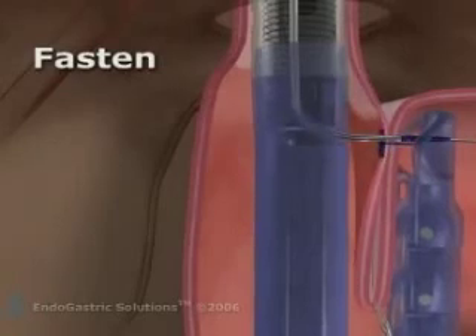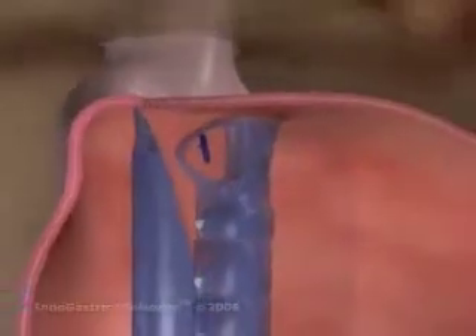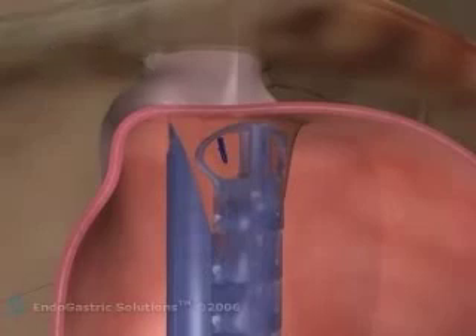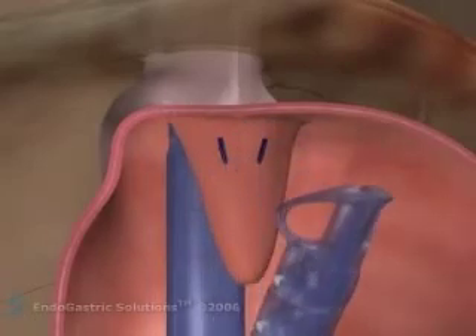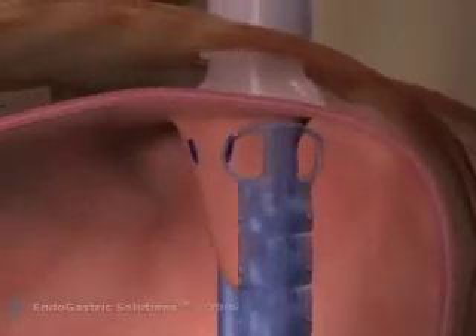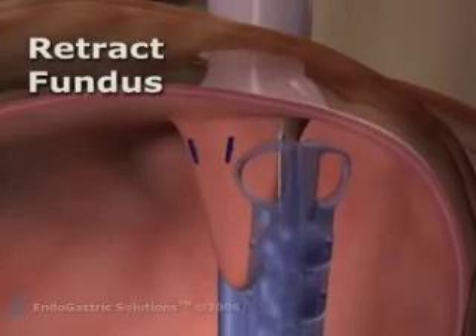From each position, under visual control, the esophagus device can fire two polypropylene H-fasteners that ride over a stylet using a proprietary over-the-wire delivery mechanism. These proprietary fasteners have been designed to deliver a serosa-to-serosa fusion of stomach tissue without the compromises of a crimping mechanism. In turn, they will form a robust, precisely placed, interrupted line of sutures. The esophagus device is repositioned by rotating the instrument and a new pair of fasteners is deployed.